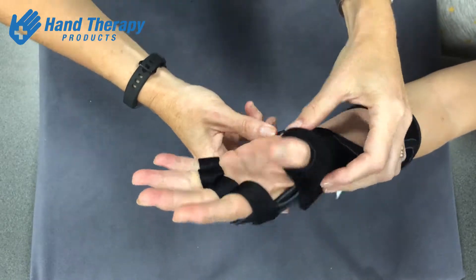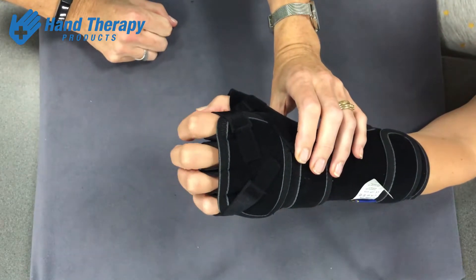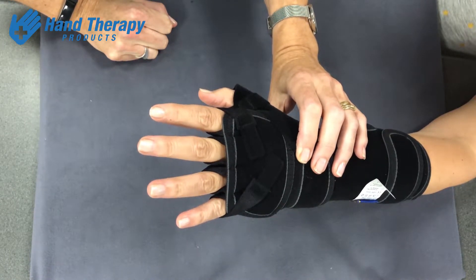With this design, because it is elasticated, it allows the client to make a full fist and grip, and then when they relax, the elastication springs the MCP joints back into extension.